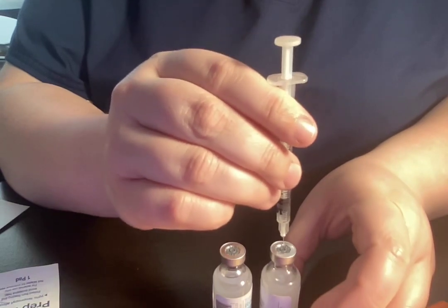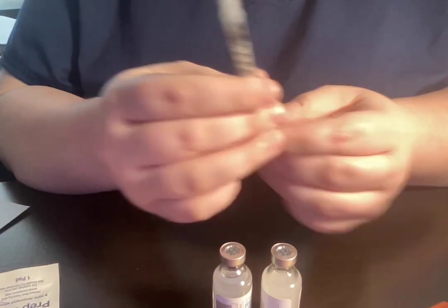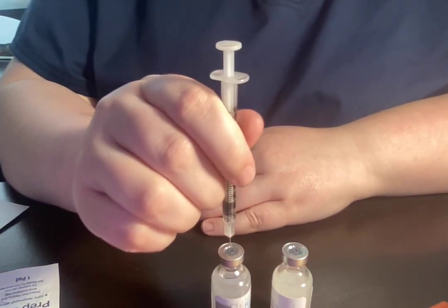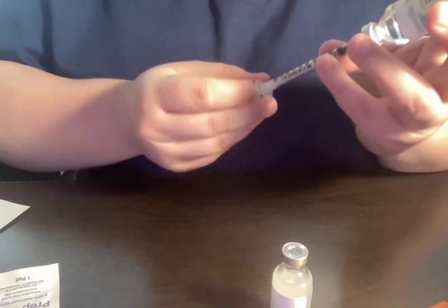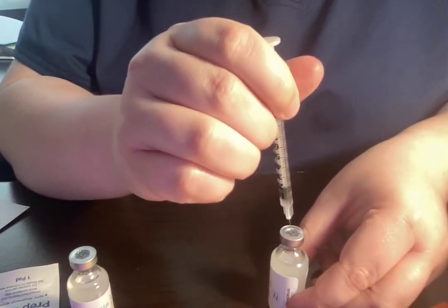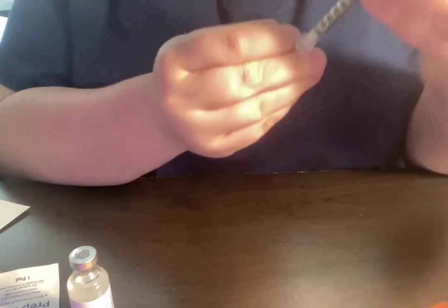I'm going to inject 10 units of air into the NPH and 5 units of air into the regular. I'm then going to draw up the regular — 5 units — and then draw up 10 units of NPH.